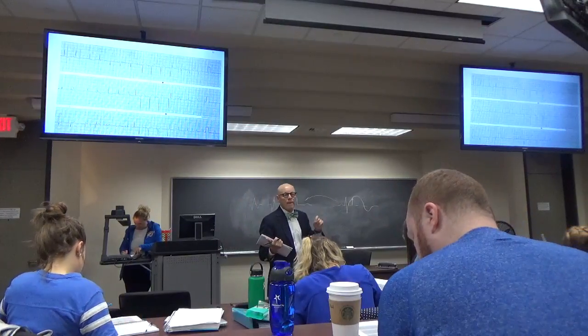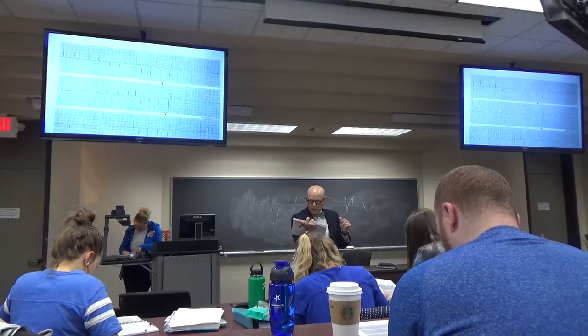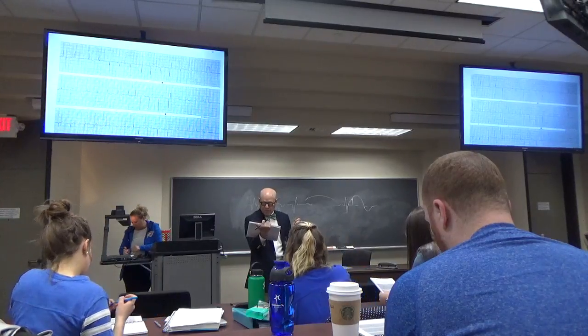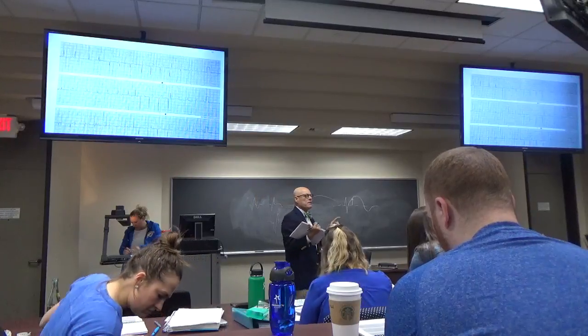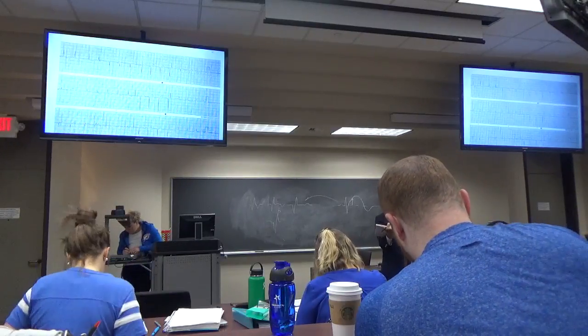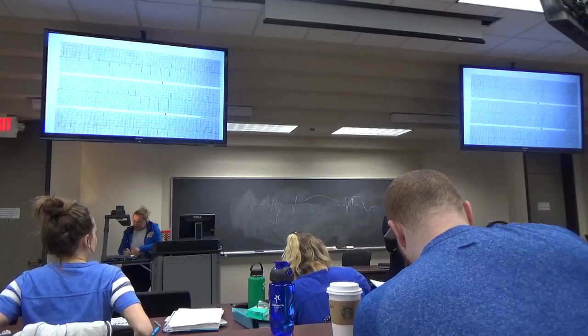Would there be LVH at all? Would there be a possibility for LVH or no? LVH? Well, those S waves in V2 are pretty deep. 5, 10, 15, 20, 25. And you've got the P wave in V1 that's biphasic. So what does that give you? 4? 5? Probable LVH, maybe LVH.